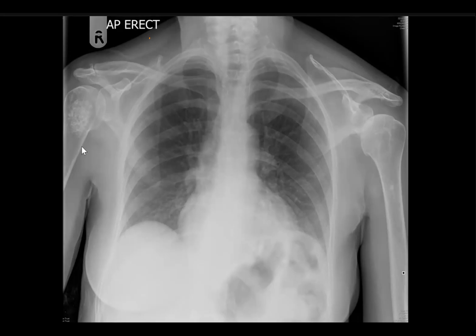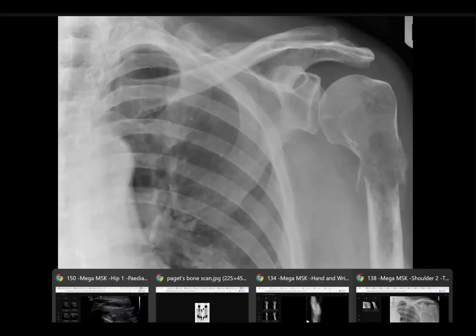However, in my routine practice, I would proceed further to MRI. And this is the first step. All friends, please concentrate. This is the first step. Comment on breast shadows. It's a very, very common exam case, mastectomy with some metastasis anywhere. Okay. Last case, nuclear.